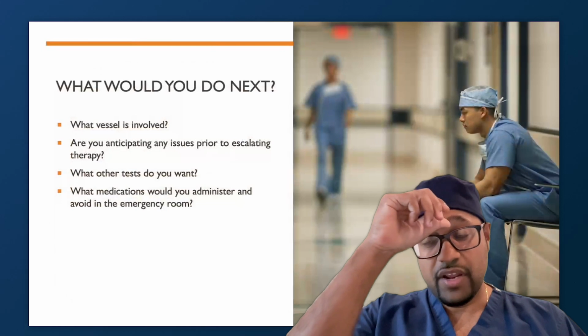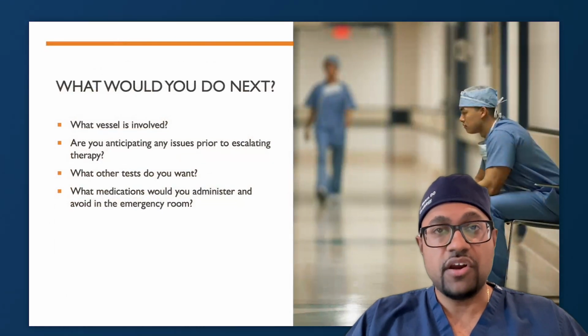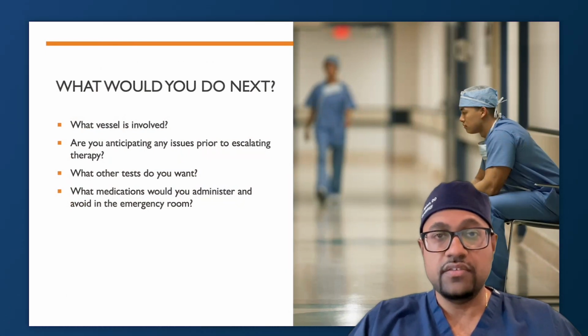So at this point, whenever you have this amount of information, you always want to think, what would you do next? What is your plan? You kind of have to anticipate things in cardiology because there could be many different things that cause a patient's presentation. So this patient has pretty clear-cut ST elevation in the inferior leads.